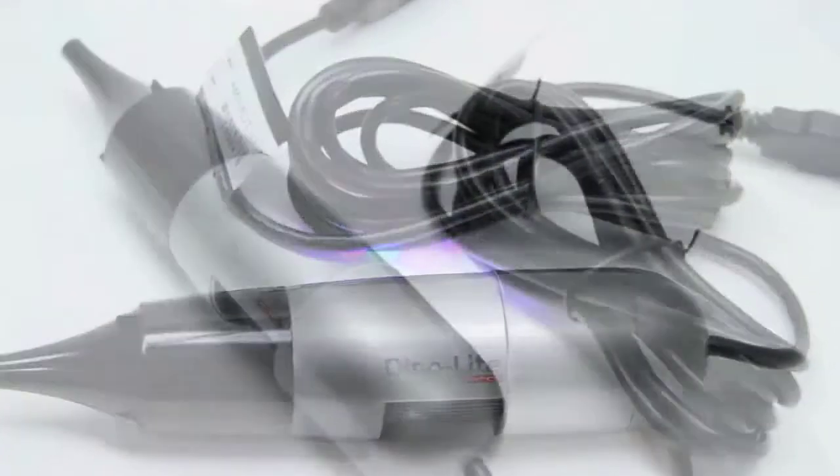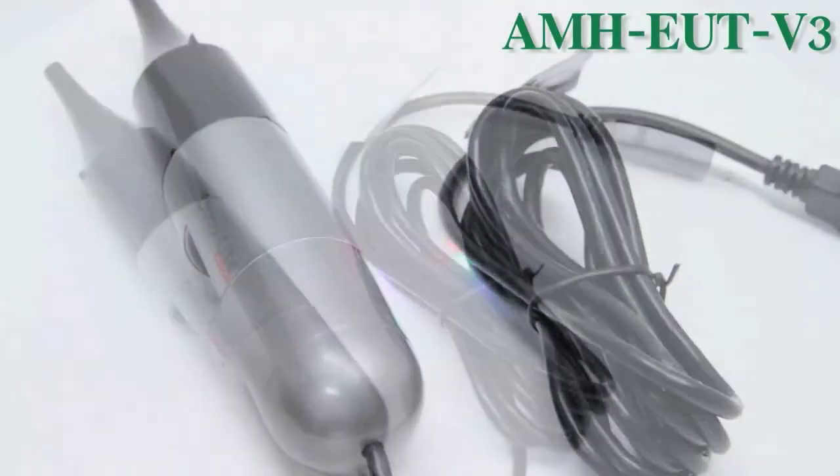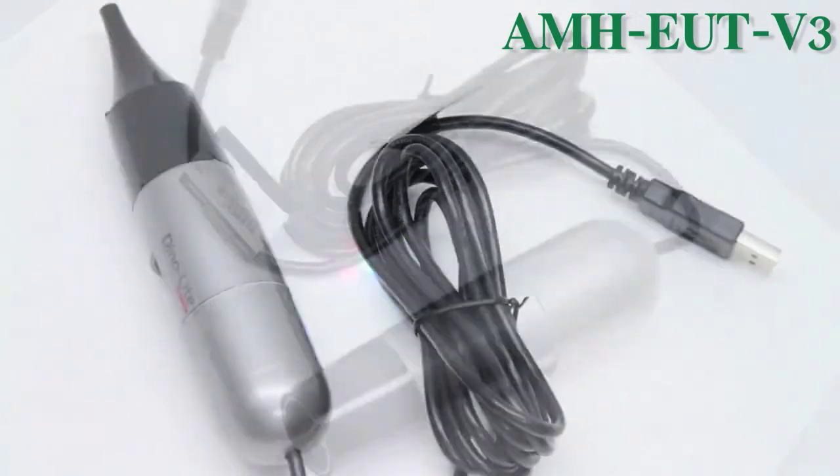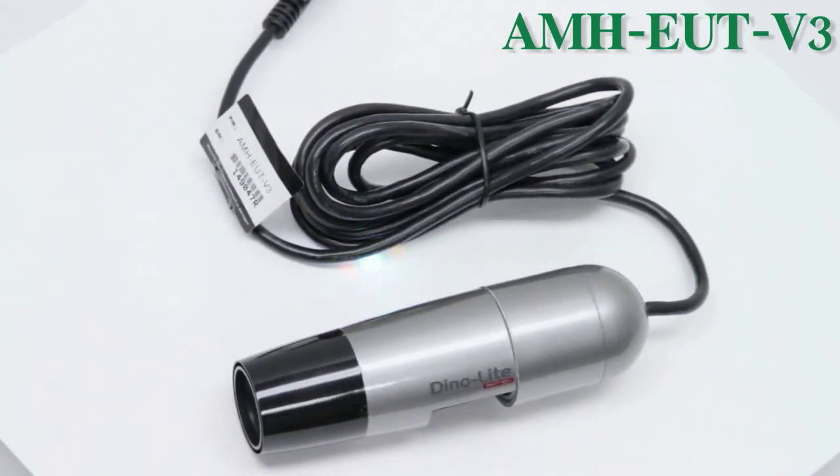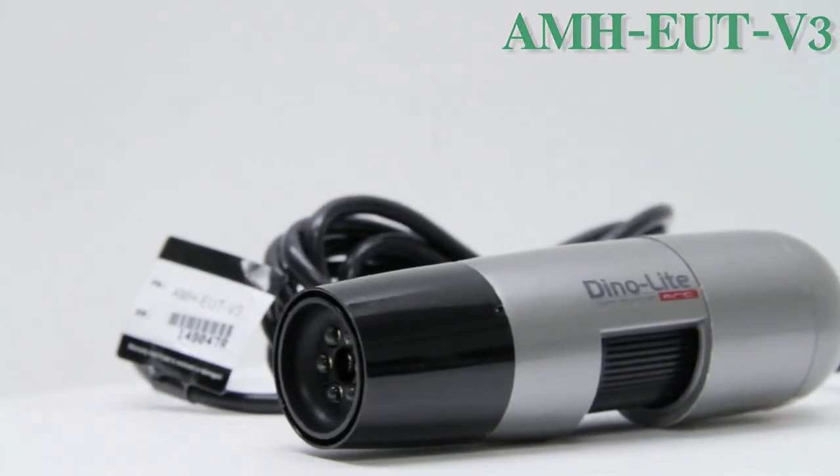Introducing the AMH EUT V3 Ear Scope. This scope features up to 30 frames per second, a 1.3 megapixel camera, as well as 10 to 92 times the optical zoom.